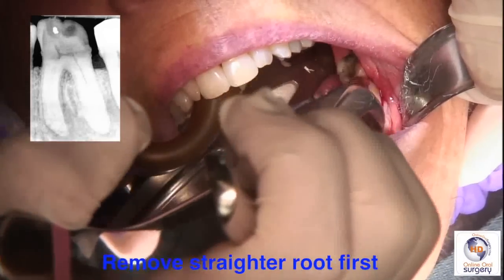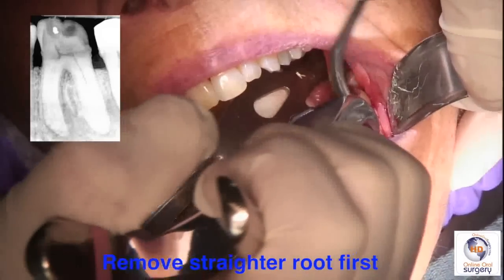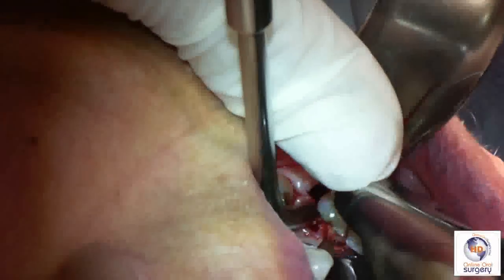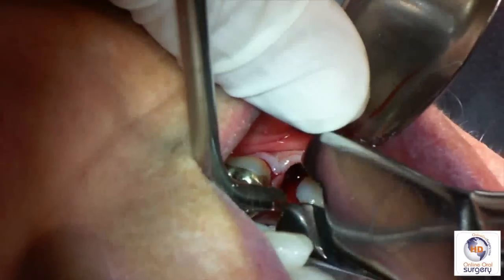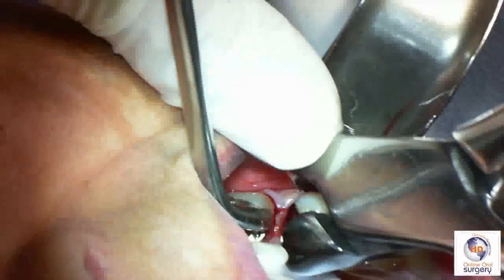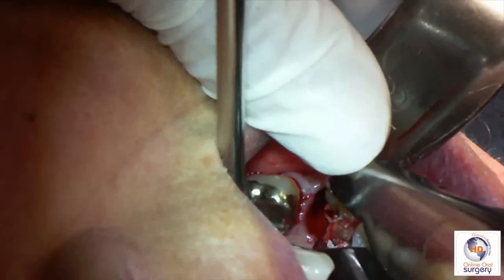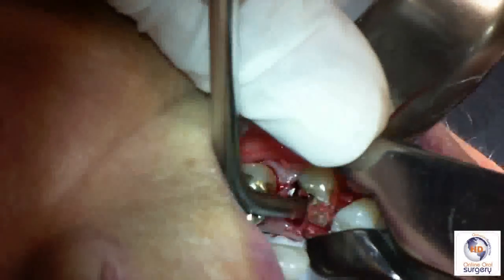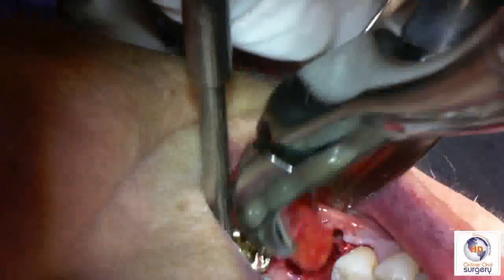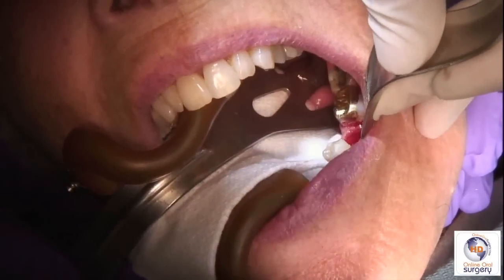The mesial root, remember, was curved distally with a gentle curve to it. Now that the distal root is out of the way, that mesial root is going to come out much easier. On the lingual we've got some tooth structure that's missing, but that's okay because we've laid a full-thickness flap — we can get our forcep down underneath the periosteum and onto solid tooth structure. And as you can see with the distal root out of the way, the curved mesial root can be lifted out with a universal forcep without too much difficulty.